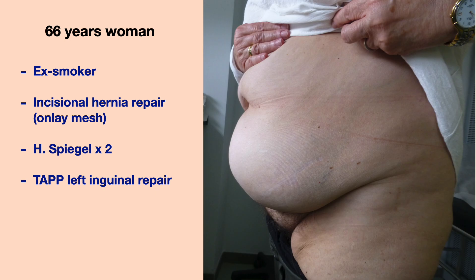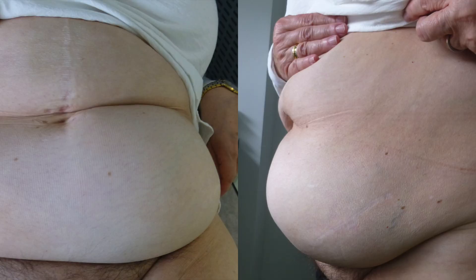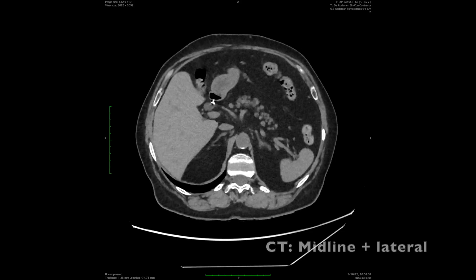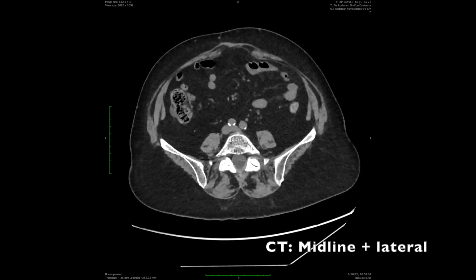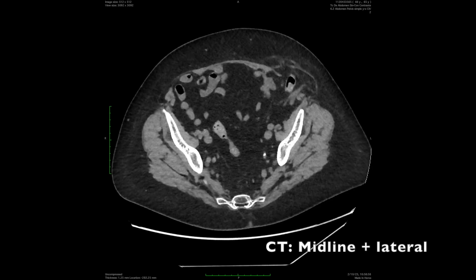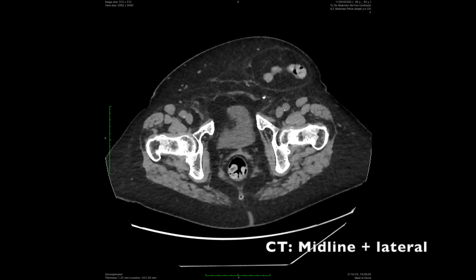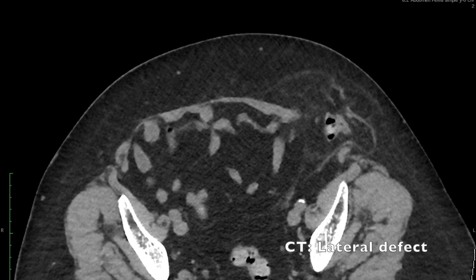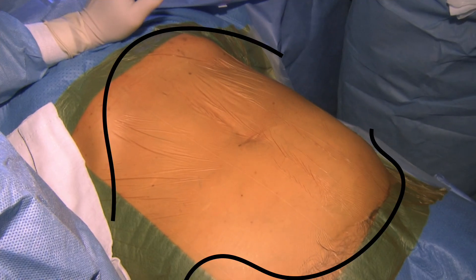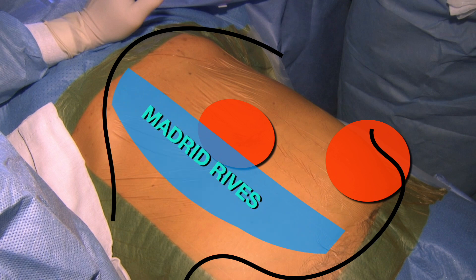This is a case of a 68-year-old woman with past history of multiple surgeries for midline, lateral and inguinal hernias. She had an onlay midline repair and the last lateral was operated by intraperitoneal mesh. The patient developed a big lateral recurrence and a smaller midline hernia. In the CT scan we can observe both defects. We plan to make the reconstruction through a midline approach by performing a retromuscular dissection on the right side and a Madrid posterior component separation on the left side.